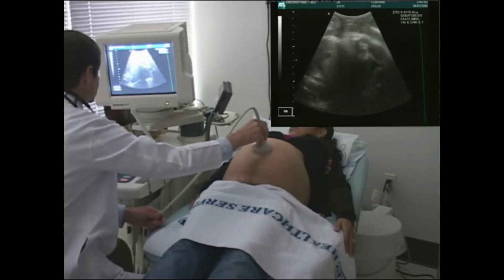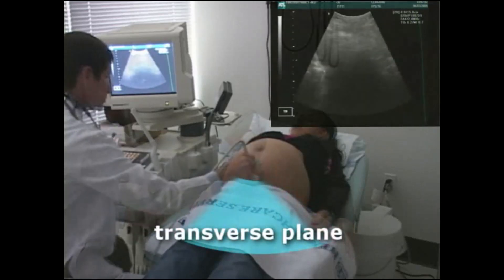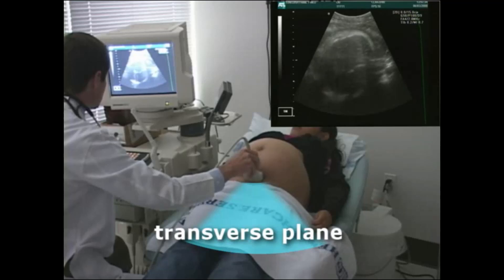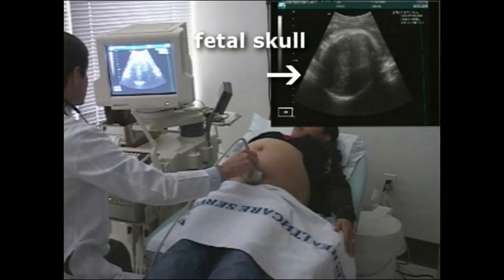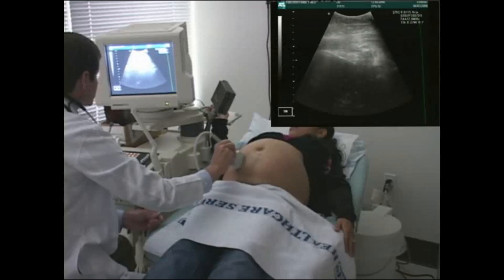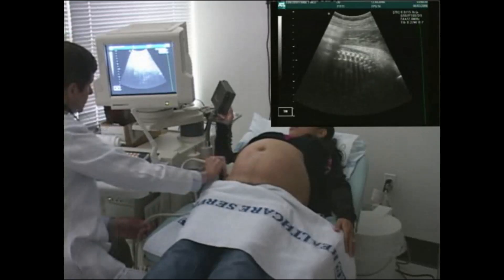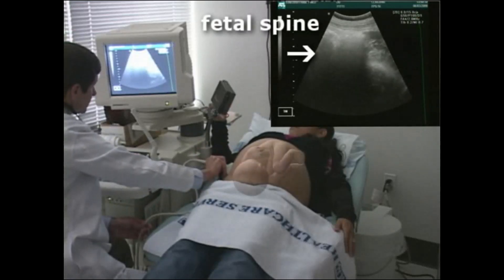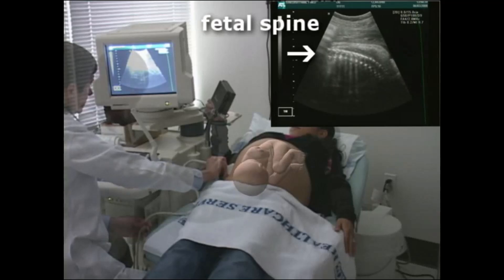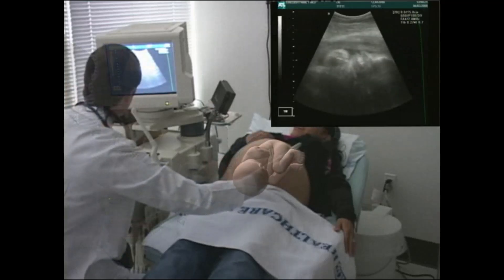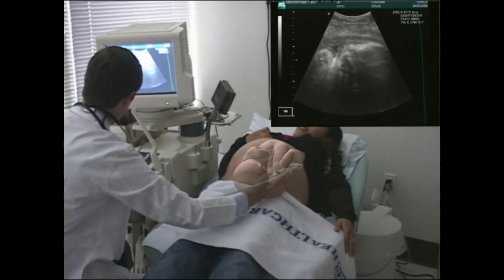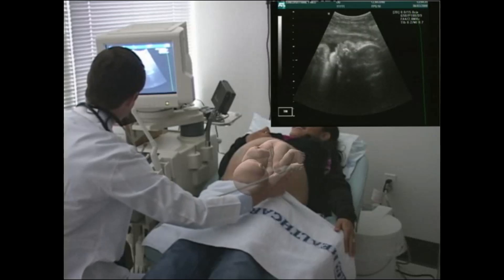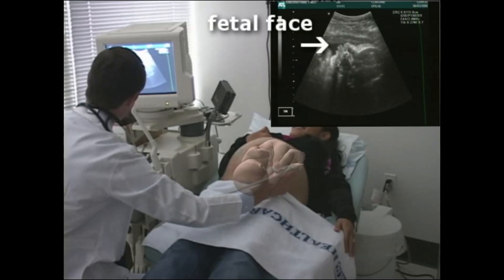To determine the fetal presenting part and orientation, begin the exam in the lower uterine segment with the transducer in the transverse plane. Determine the location of the fetal skull. The presence of the fetal skull in the lower uterine segment confirms the vertex presentation. To determine orientation, visualize the long axis of the fetal spine. After getting oriented to the fetal spine, you will be three-dimensionally oriented to the fetal position. Visualize fetal extremities or face to confirm position.